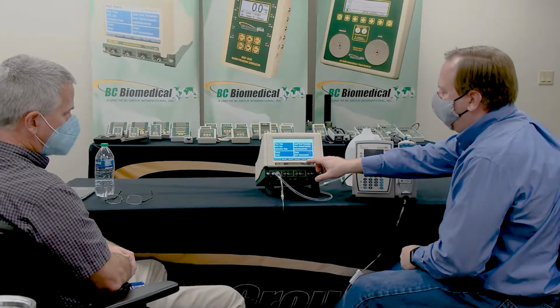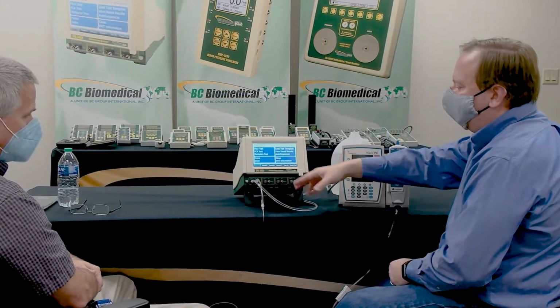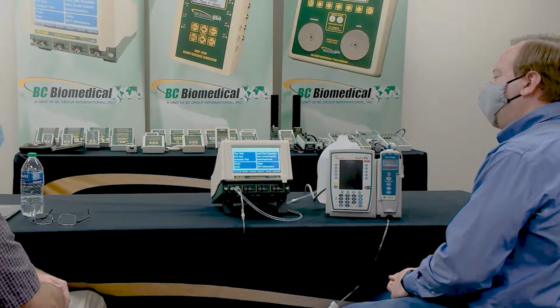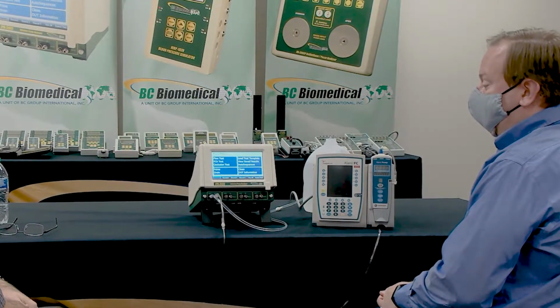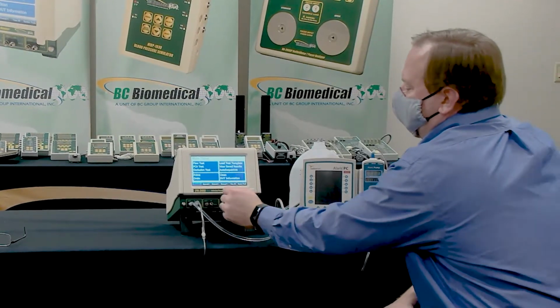So then we have our prime and drain. Again, Ken just mentioned drain. Before you send in the modules, you should really do a drain to clear all that fluid out. And actually, when you're done testing at the end of the day, it's even a good idea to drain it to get all that residual fluid out as much as possible.